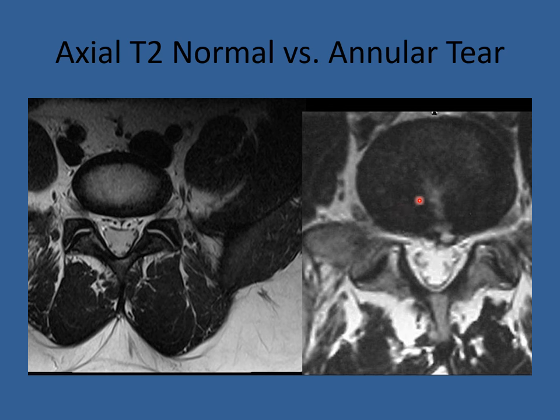Here is our first pathology: an annular tear. You'll notice the color of the disk space, which should be white, is now dark. You can see a tear going right through the annular fibers and even a small disk bulge. It doesn't compress the nerve roots, so I wouldn't expect any buttocks or leg pain, but it does tear through the posterior wall. This patient had some lower back pain.